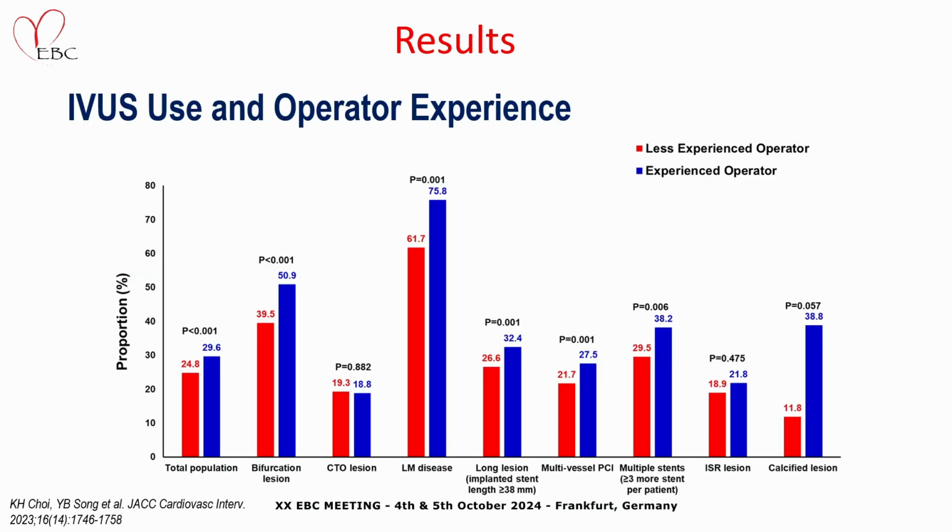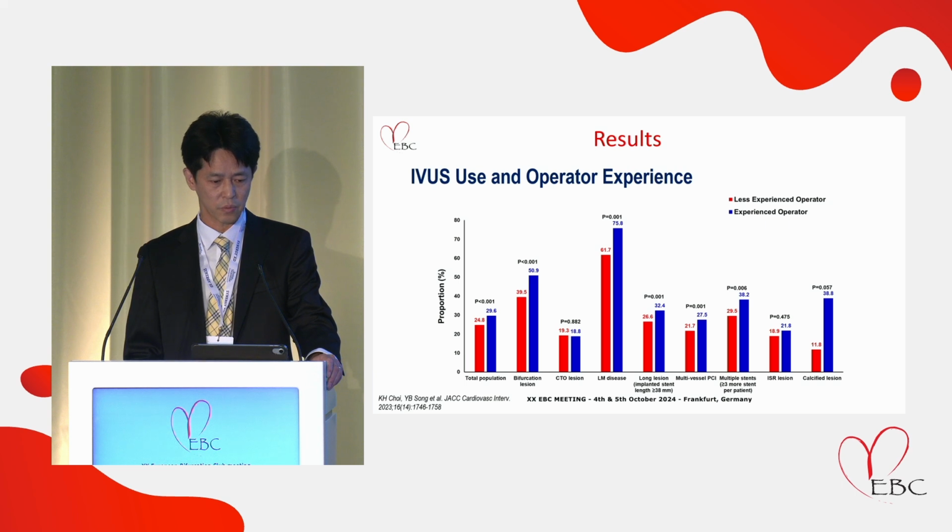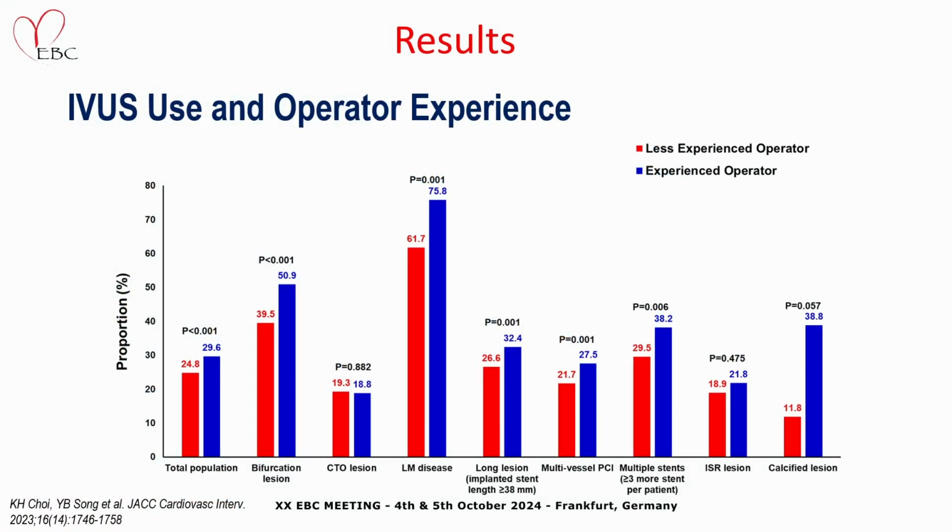The experienced operators used IVUS guidance more frequently compared to less experienced operators, 29.6% versus 24.8%. This trend was consistent across nearly all complex lesion types.